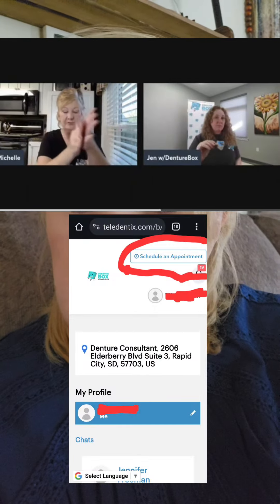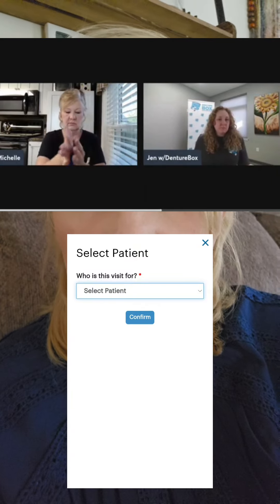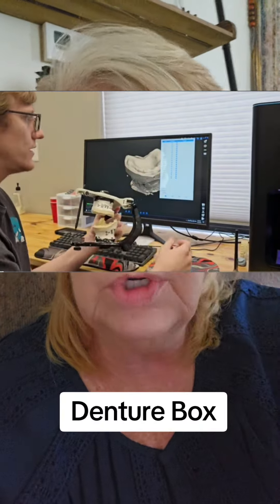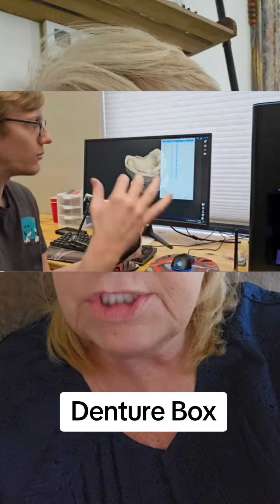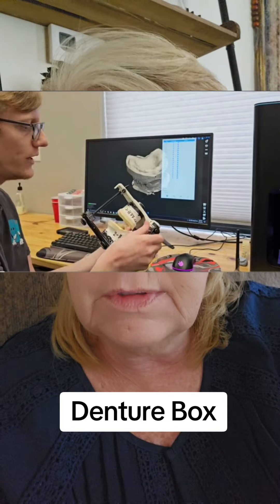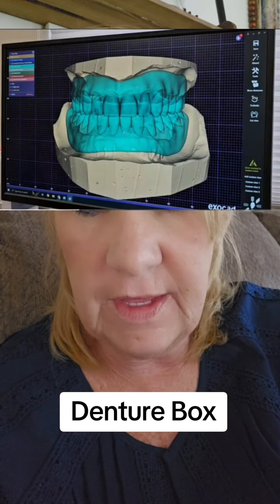They have a whole list of questions they go through to find out what kind of denture you want. What are you looking for? Do you want it to look aesthetically gorgeous? Do you want it to function better? They'll take all your notes and preferences into consideration.